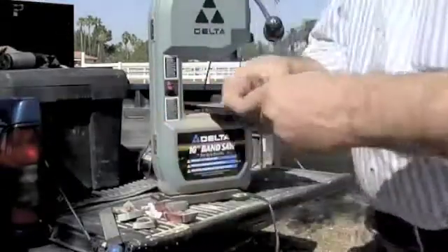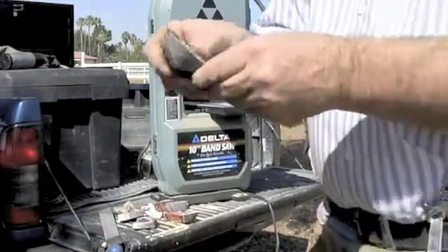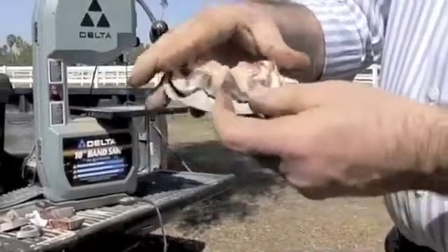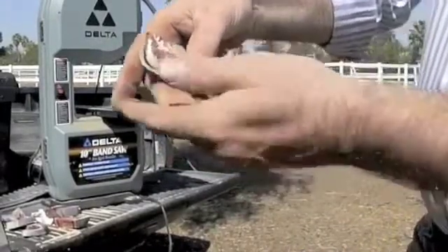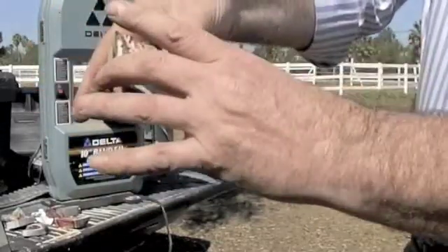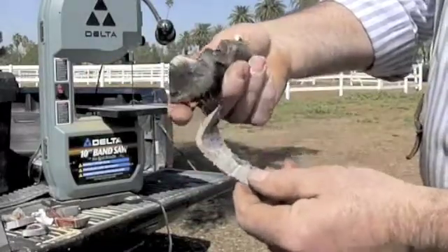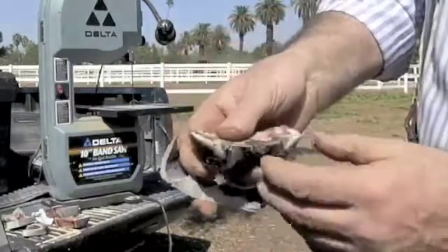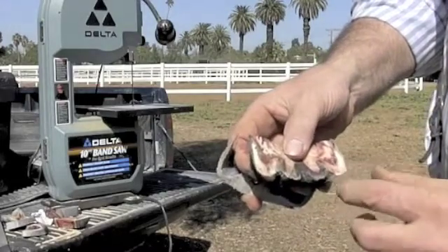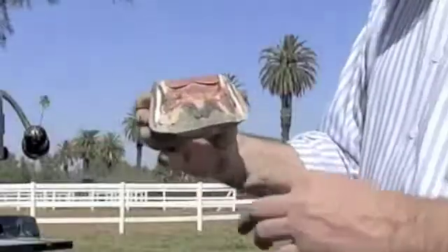What we've got now is a cast on the foot providing good caudal support. We have good ground support and wall support, giving us vertical integrity and lateral stability — stabilizing the whole hoof. By reading these collateral grooves from an exact copy of the foot, we can read it much more accurately. This one's not as long, this one is long, corresponding to the same thing in the central sulcus. Reading the collateral grooves is critically important — shallow, deeper, longer.